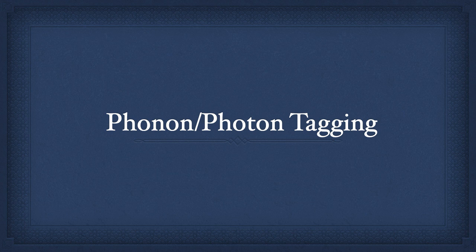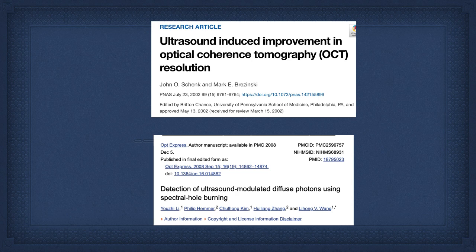So if the photon and the phonon interact in lipid versus when interacting in water-based tissue, it's going to send you back a different signal. So this is very promising, but it also works in two different ways. It's actually two techniques.